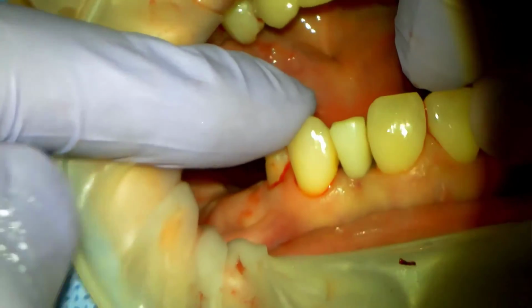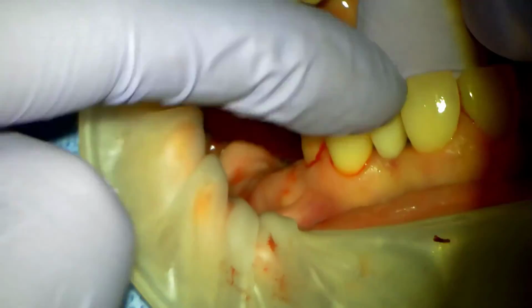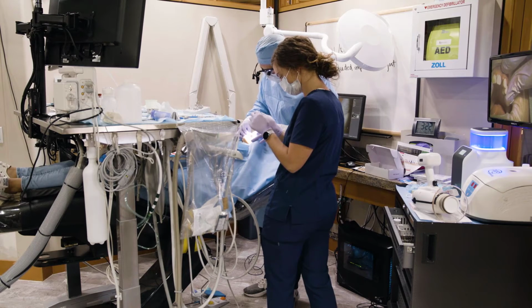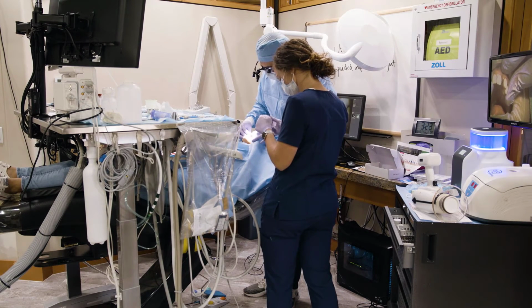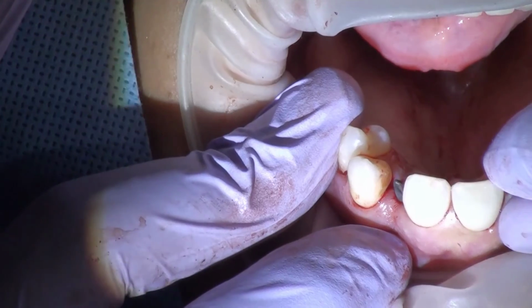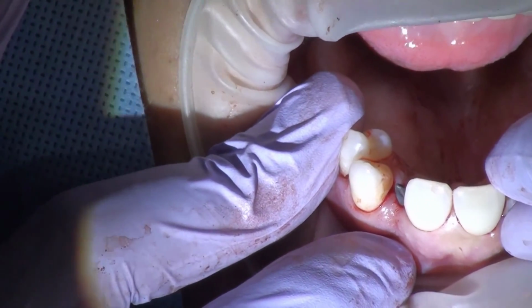I've done this quite a bit, but every time I do it, it still kind of blows my mind that that even works, that that's accurate. That's phenomenal. And in this case is all done. We've tried in the temporary, we've confirmed occlusion, we've looked at proximal contacts. I'm going to go ahead and cement the temporary. First thing I'm going to do is put a little Teflon in the back access, and then we'll put a little temporary cement on this abutment, double check occlusion, and in this case is all done.